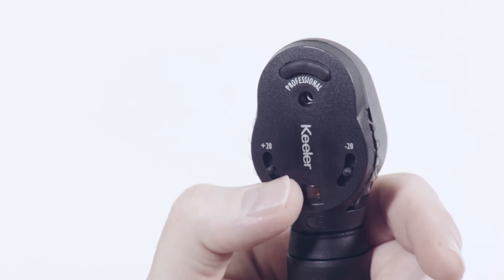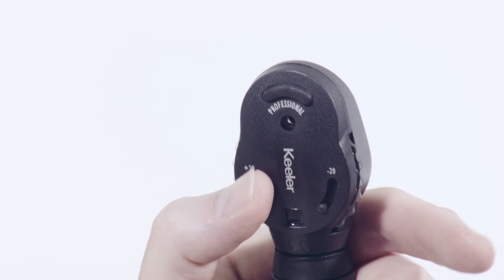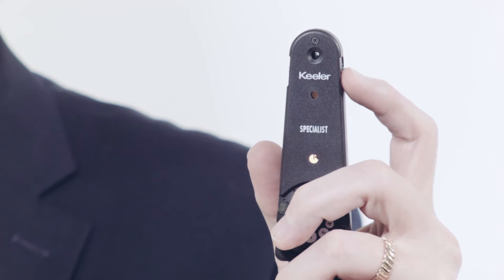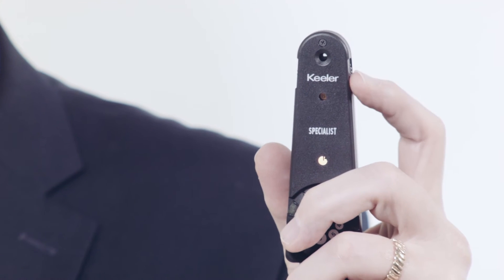The Professional Ophthalmoscope features an auxiliary lens wheel with swings of plus or minus 20. The Specialist auxiliary lens wheel aligns plus and minus 10, 15, and 30 diopter lenses.